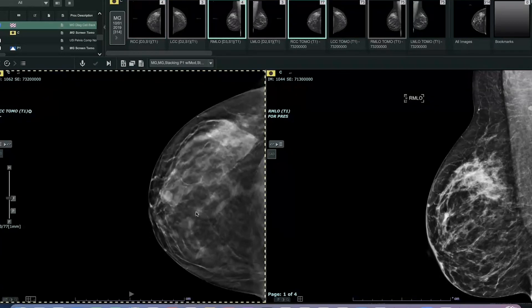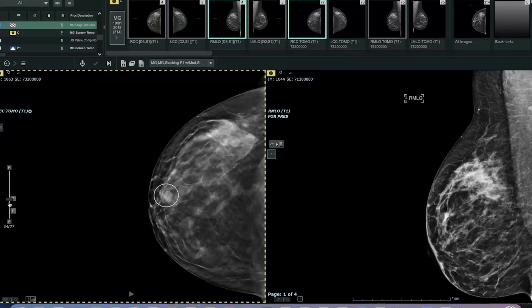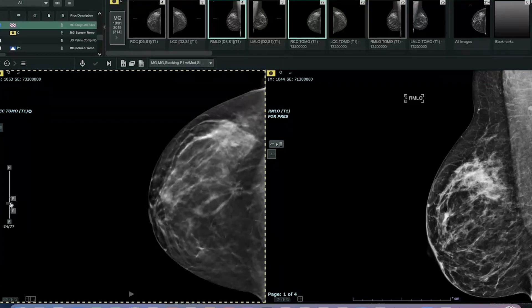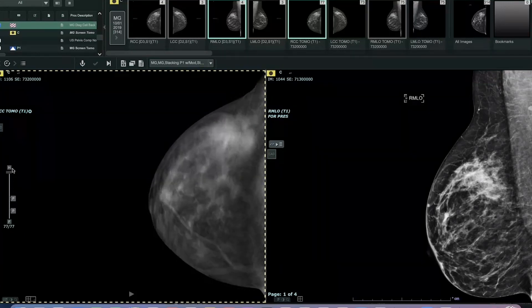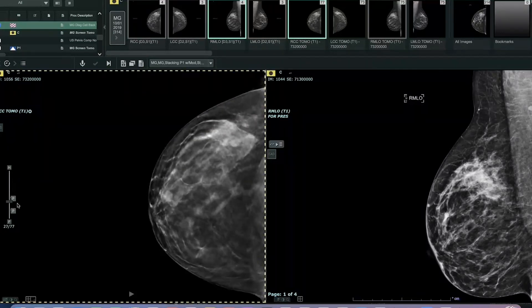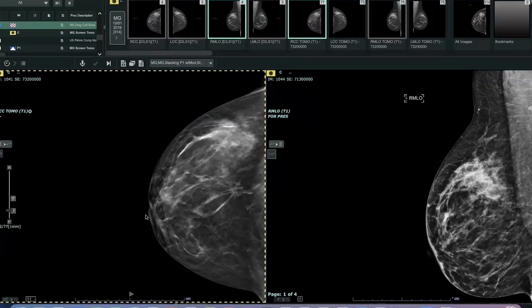I want to show you the 3D images. When we get to the 3D images, we start by looking at the most inferior skin and scroll through the breast until we get to the superior breast tissue. Now I'll stop to show you the findings. Within the inferior part of the breast, centrally, slightly laterally, behind the nipple, there is a mass with associated spiculated margins — these little lines coming out from the finding.